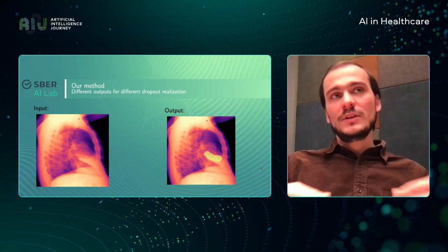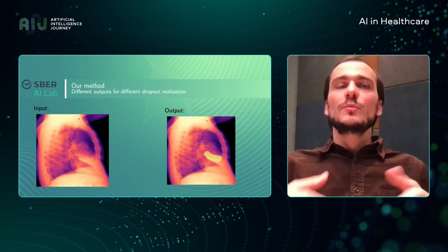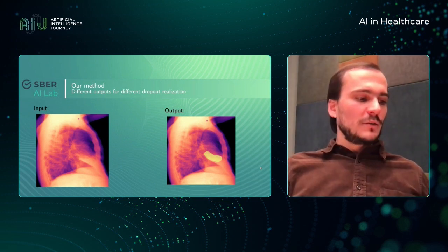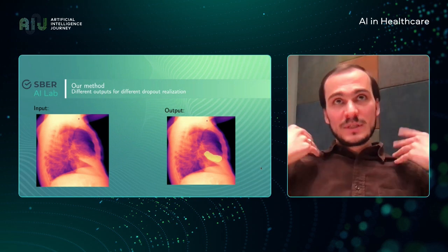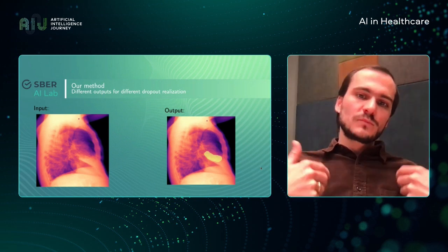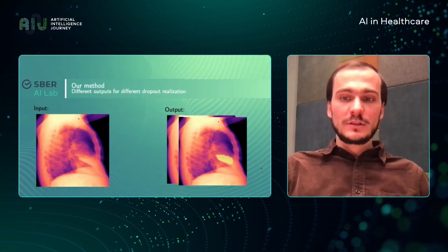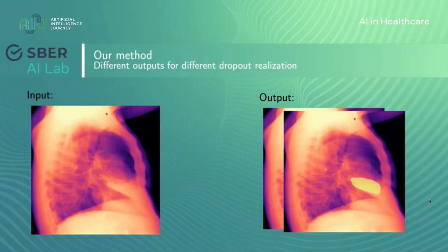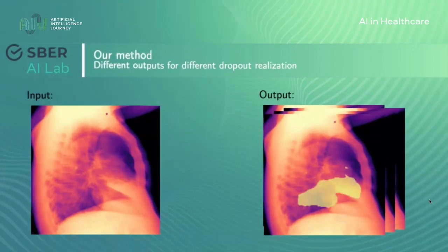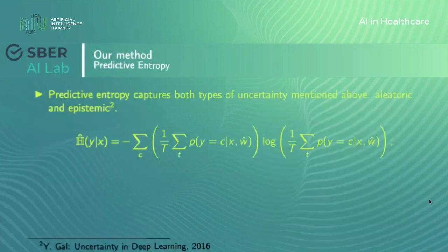And when predicting, you just keep your dropout network switched on, and you send the same picture, and then average and smoothen the result. When we are switching it on during predictions, yes, predictions might be different. So this is the input and the output, and we make the smoothing through pictures that are shown to the right.